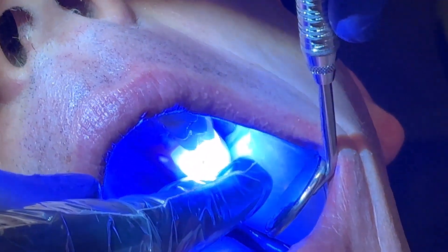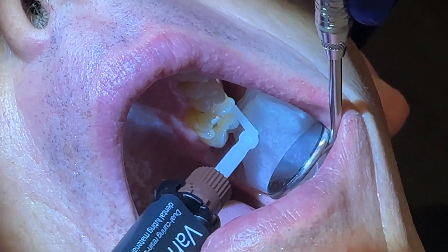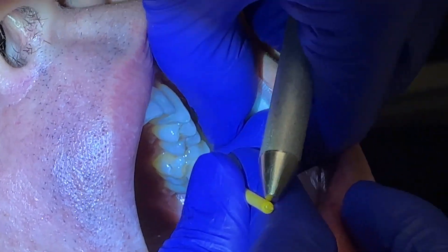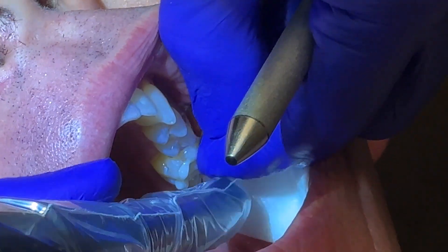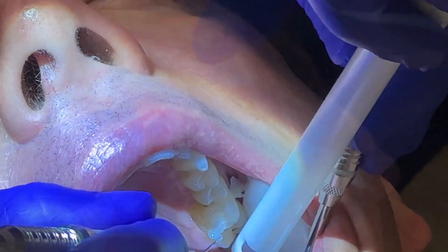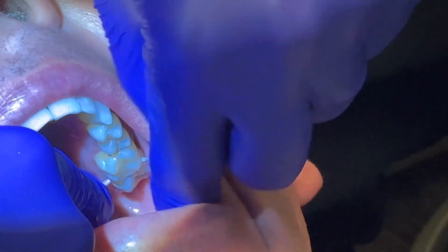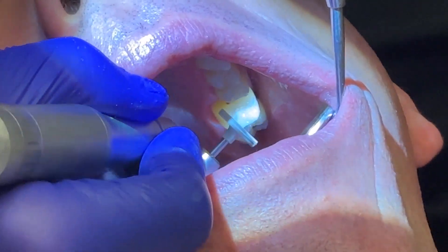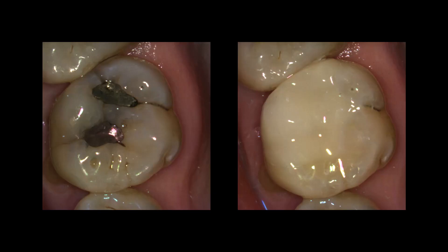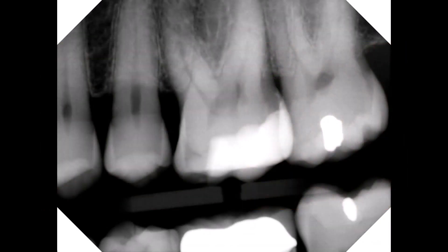The last step is adding the Variolink, the resin cement, and then seating the onlay. Now he's just poking around and getting rid of all that extra cement. Checking the contacts with floss — and no, that's not more of my spit, that's actually a piece of floss. And some final polishing to make it look nice and pretty. And the big before-and-after reveal — everything looks good, looks nice and pretty, feels good in the mouth. Margins look great. We're a happy guy.